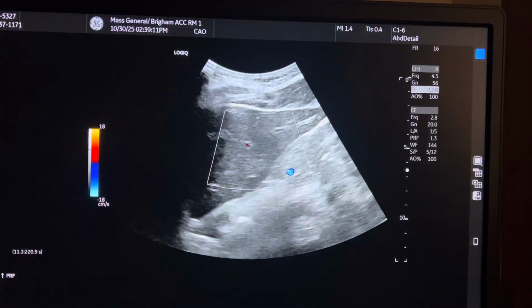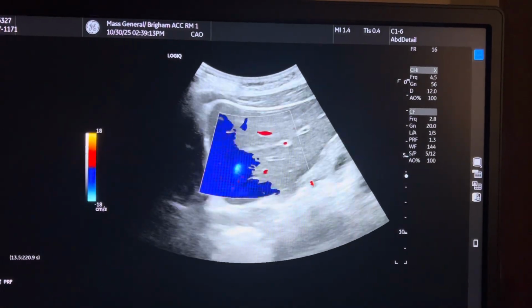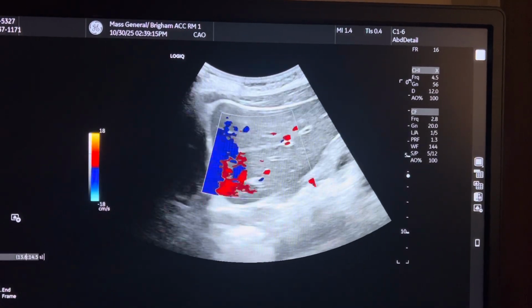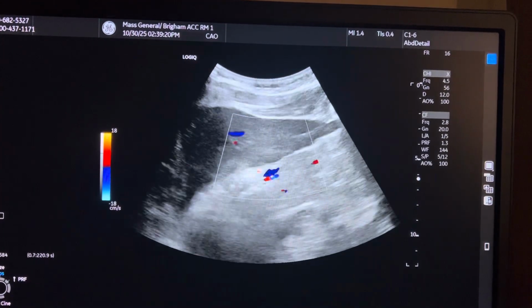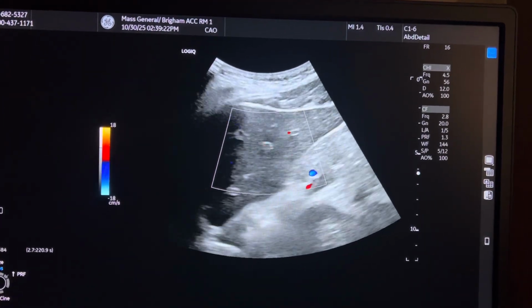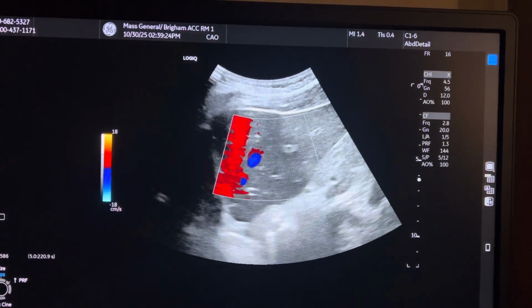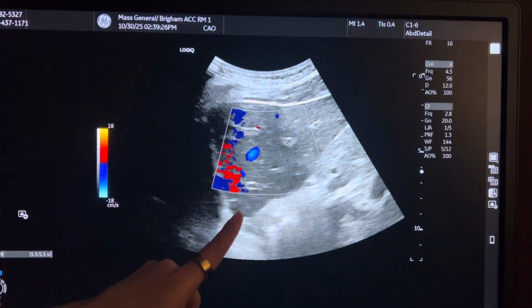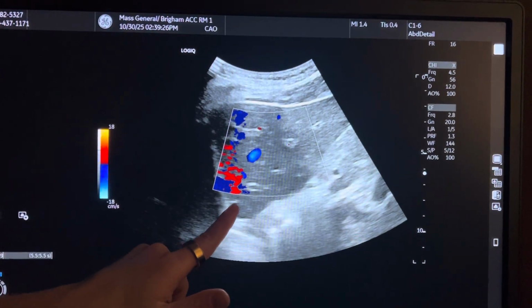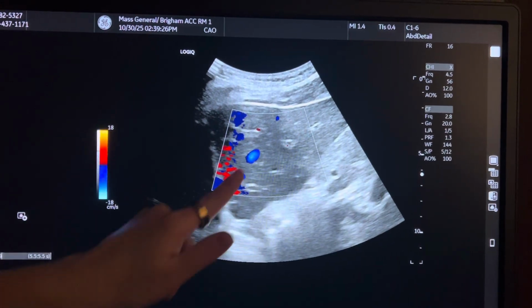Big breath in and hold it. So we can see it right here. Breathe. Oh, let me get a better one. Small breath, nothing crazy. Breathe. So this is my left hepatic vein right here. Sometimes you can see it from the IVC kind of darting into the left lobe like this.